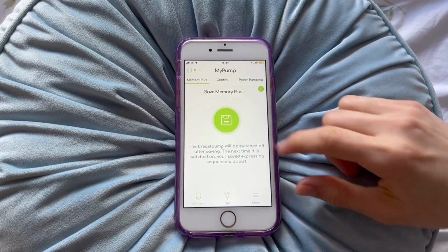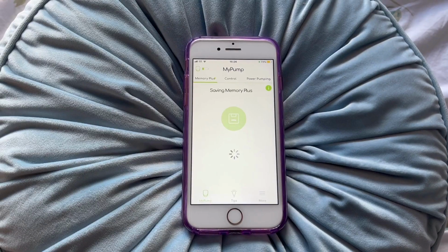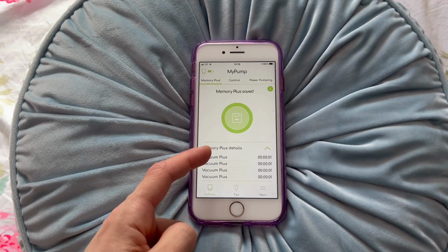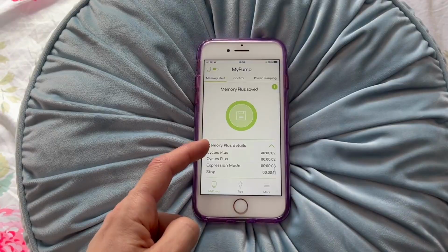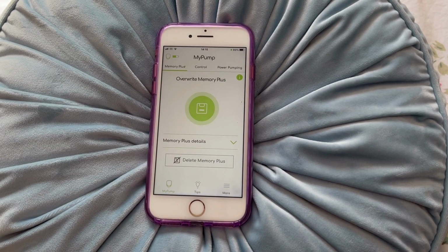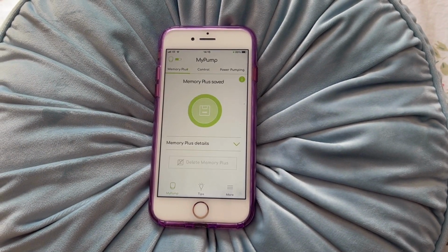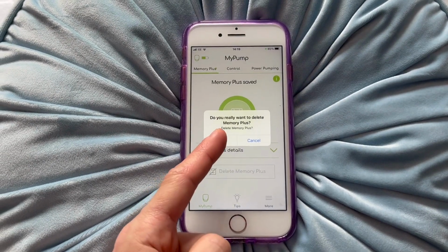Swipe across to Memory Plus and easily save a whole expressing session when you find the settings that suit you best. Tap the Save button. You can also click to view a detailed history of the settings used. If you save an expressing session in Memory Plus, it will automatically replay the next time you turn your breast pump on. However, you can exit Memory Plus at any time via the app. By adjusting the vacuum or cycles, you can overwrite the old session with a new one by clicking Save again. You can also easily delete a session via the app.